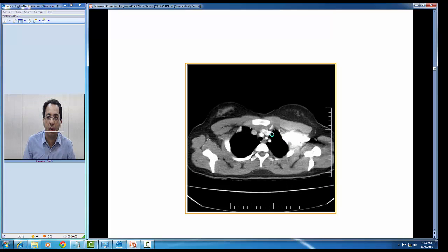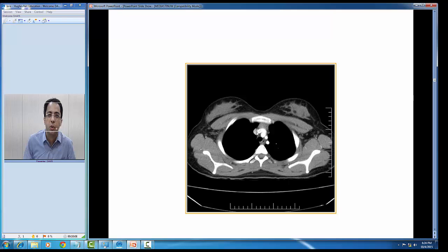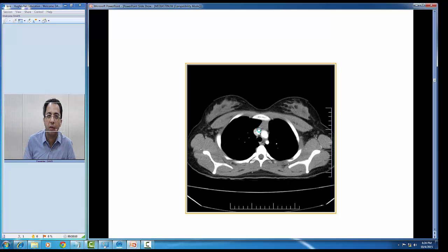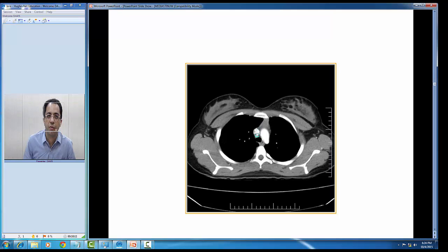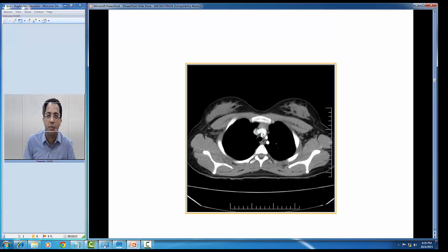You can see the brachiocephalic vein from the left side crossing over and joining the right side brachiocephalic vein to form the superior vena cava. This is the superior vena cava.